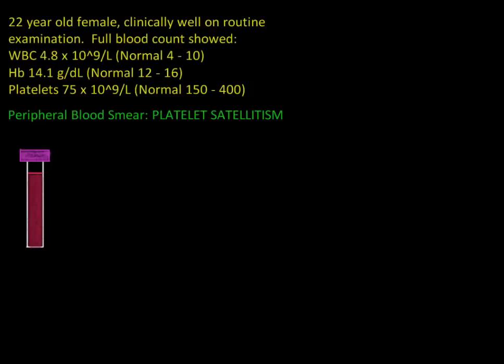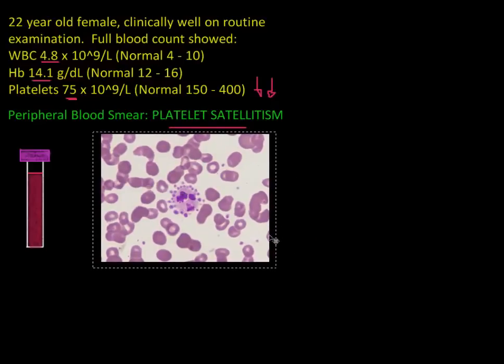Today we have an interesting case of a 22-year-old female who was clinically totally normal on a routine medical examination. A full blood count showed a normal white blood cell count and normal hemoglobin, but she had a low platelet count — an isolated thrombocytopenia. What was reported on the peripheral blood smear was platelet satellitism. You can see here a neutrophil in the middle of the screen surrounded by small platelets. We call that platelet satellitism or rosetting.